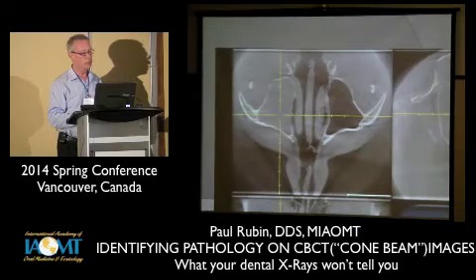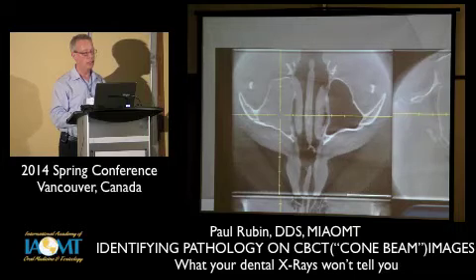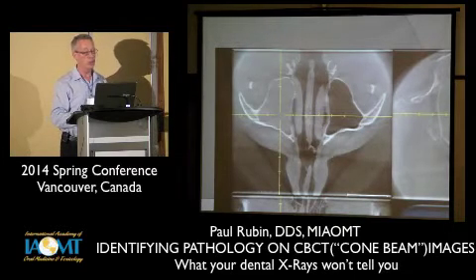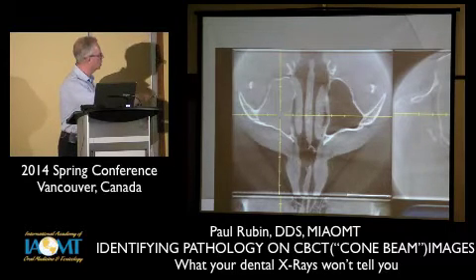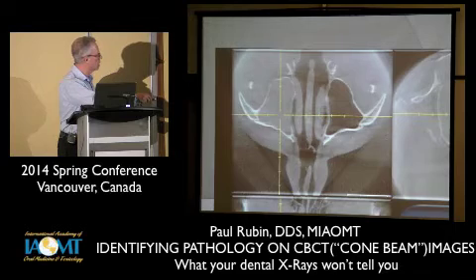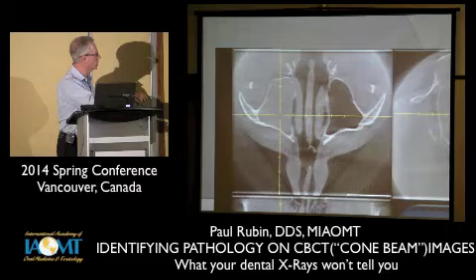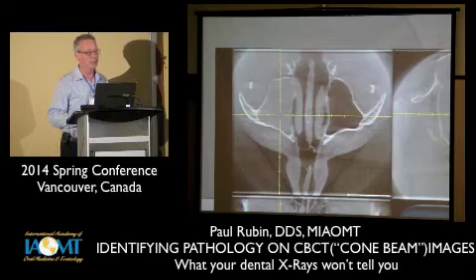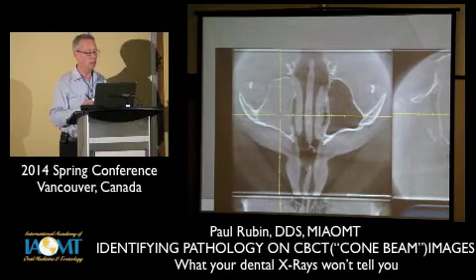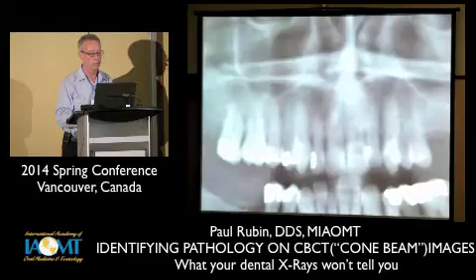Here's an example of looking at an axial view of the sinuses. The sinus on the right side of the screen, the patient's left sinus, looks normal. And again, look at the wall of the sinus here. It's thin. You don't see that thickened membrane. This is pretty normal. This one is all filled with junk. Fluid, snot, whatever you want to call it. It's an infected sinus, more like an acute sinus infection going on. This is probably something that would resolve itself without much treatment.